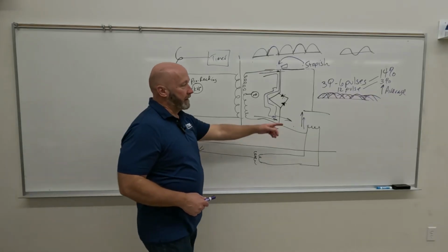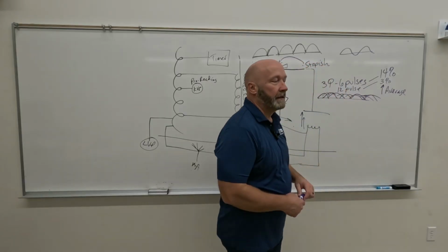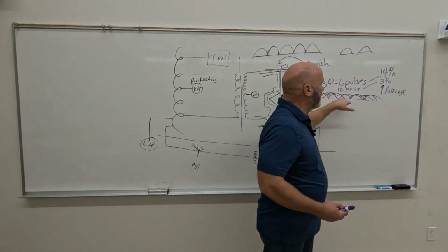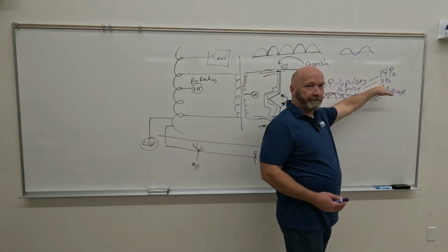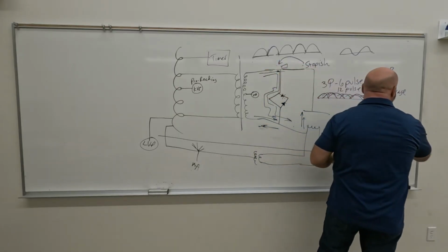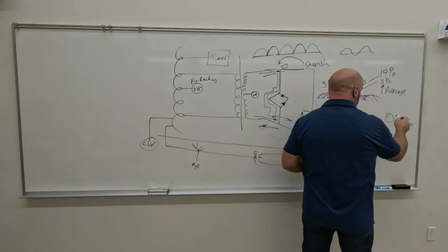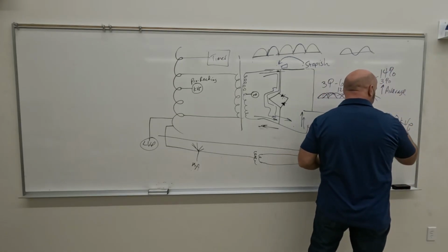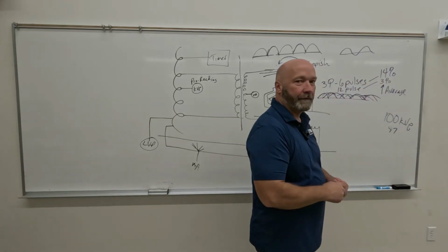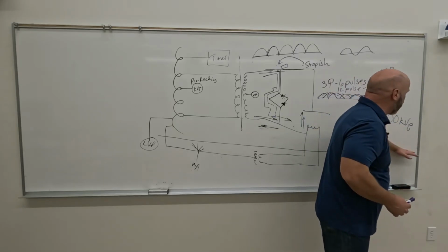Okay. Let's say we got 3% ripple, voltage ripple, off of a 12 pulse. So let's say we use the basic circuitry of the 12 pulse and we account for that 3% voltage ripple. So you set a technique of 100 kVp on that 3-phase machine, and you can get, at the bottom of that voltage waveform, 97. That's still pretty good, right? It's still penetrating anything the patient has, but it's still a 3% drop.